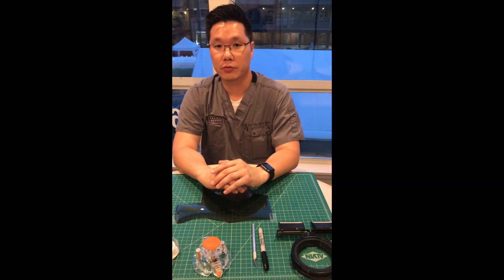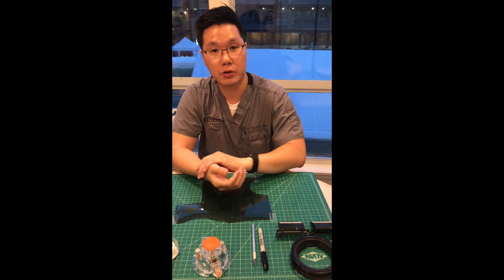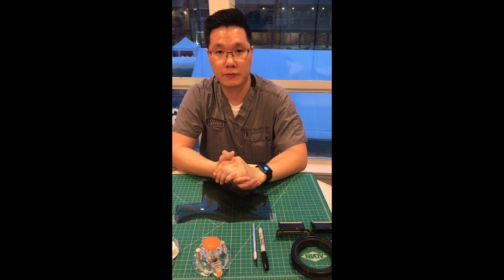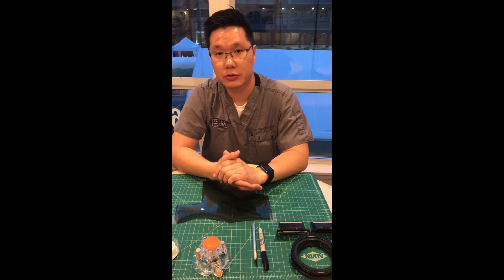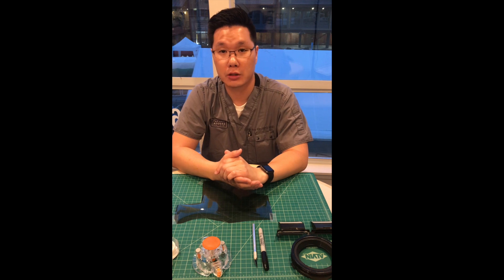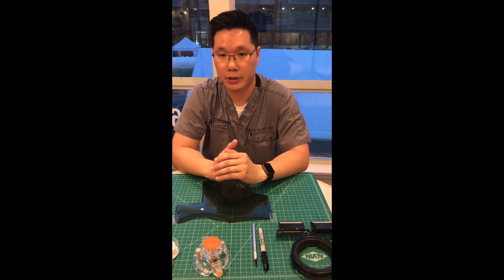Hello, this is Dr. Jason Kim from Pacific Modern Dentistry. Today I'm here to demonstrate how you can make a cross polarizing filter at home. A cross polarizing filter can be very useful when you're taking dental photography — it reduces the glare within the photos so that you can get the true shade of the object that you're trying to photograph.